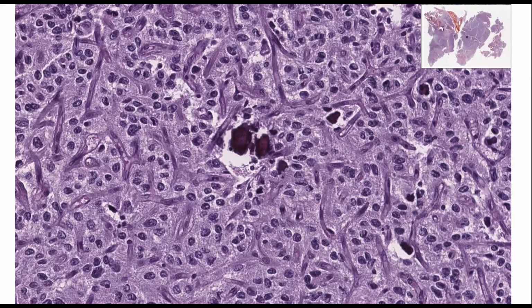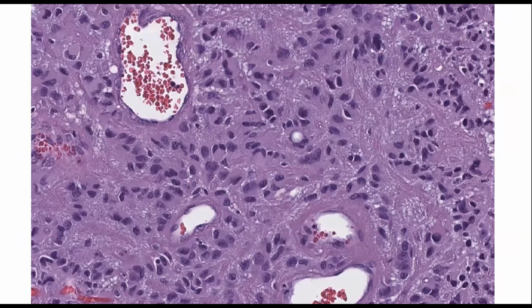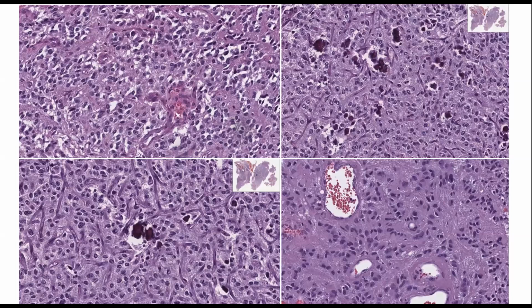Your brain's registering it. Diagnostic radiologists and surgical pathologists are expert pattern recognizers. We're really good at it. Okay. And then here is the last of the 4 H&Es. Again, there's another pattern here. This is all the same tumor, just different areas, slightly emphasizing in the different areas one or another feature over the other. All right, and there are all 4, in miniature, and you're taking in this pattern.